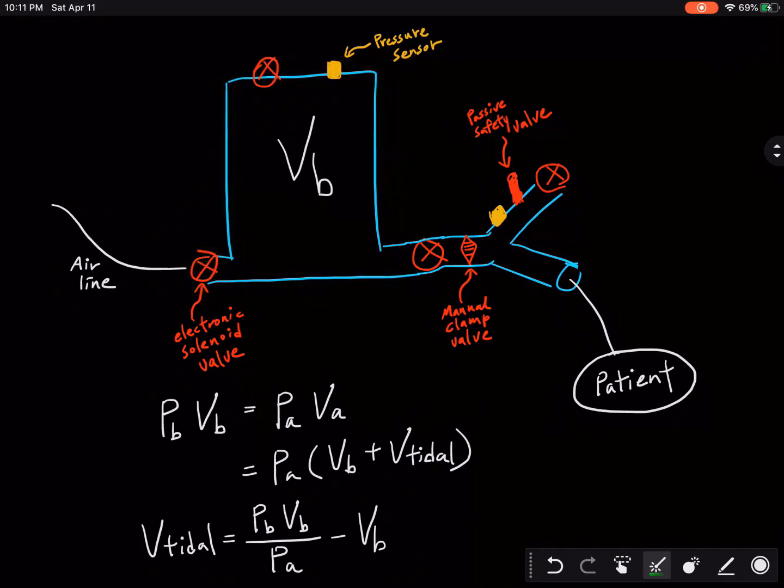We can set the inspiratory and expiratory ratio by adjusting the clamp valve here. The more open the valve, the faster the flow through this channel, and the shorter the inspiration period is, and vice versa. The ventilation pressure is continuously monitored by this pressure sensor here.